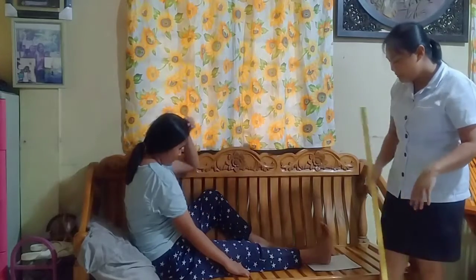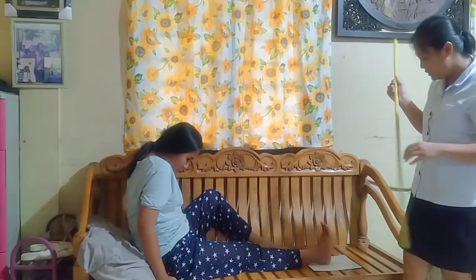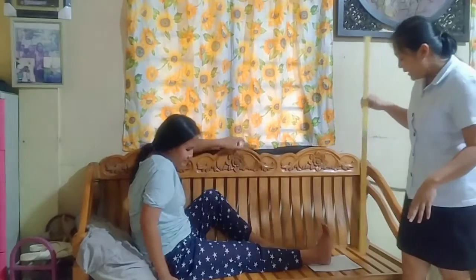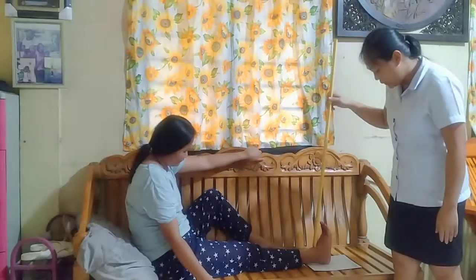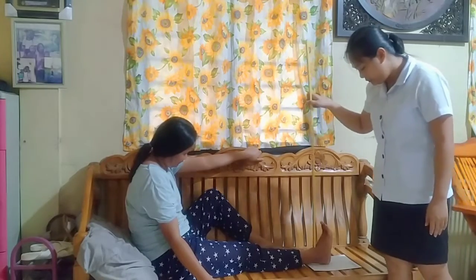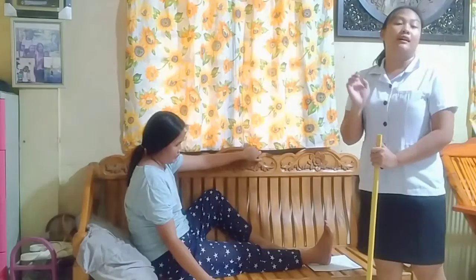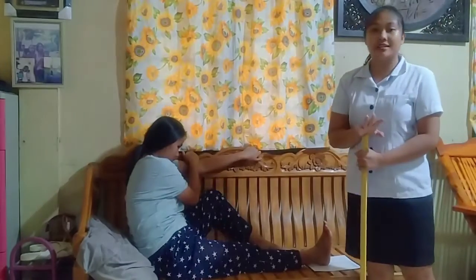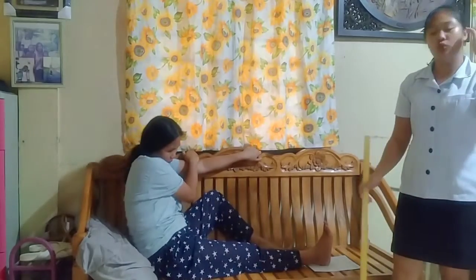Now, the central ray will be perpendicularly directed to the ankle joint. Now, this projection shows distal tibia and fibula and tarsal bones.